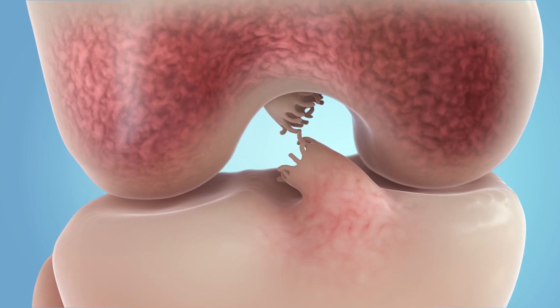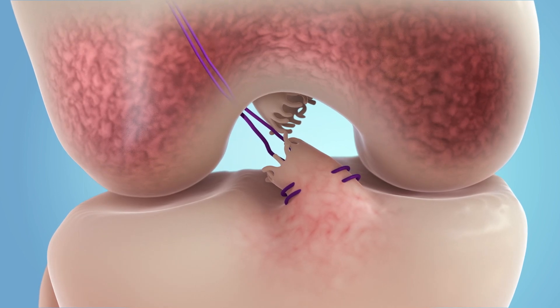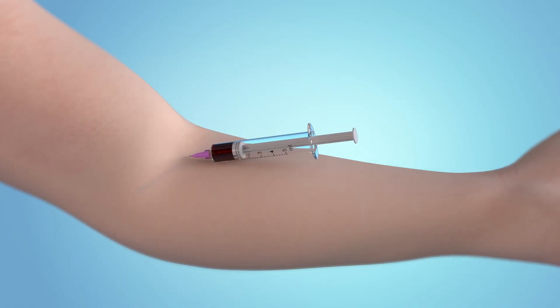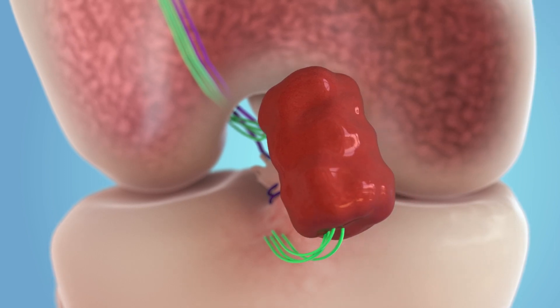First, the surgeon places sutures to stabilize the ACL and the knee. The implant, made of special proteins, is then positioned on the sutures while blood is drawn from the patient. The blood is then added to the implant, creating an environment for a clot to form.